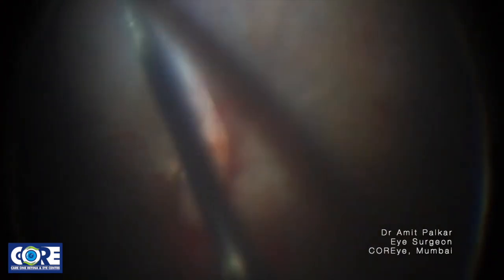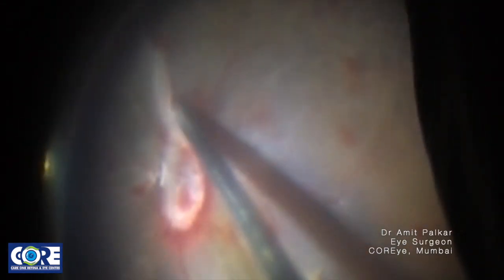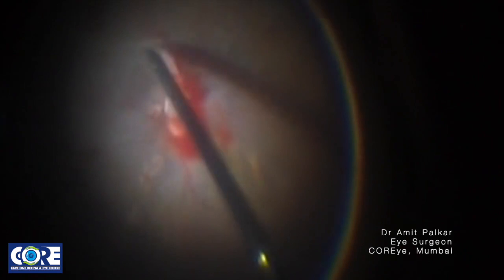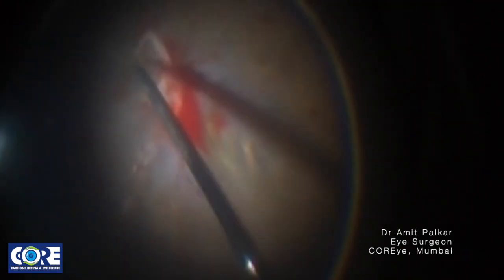And now inferonasally, the hyaloid needs to be separated. So we go back again on the wide field lens to tackle the hyaloid and reduce the anterior posterior traction so that we don't have any peripheral breaks.